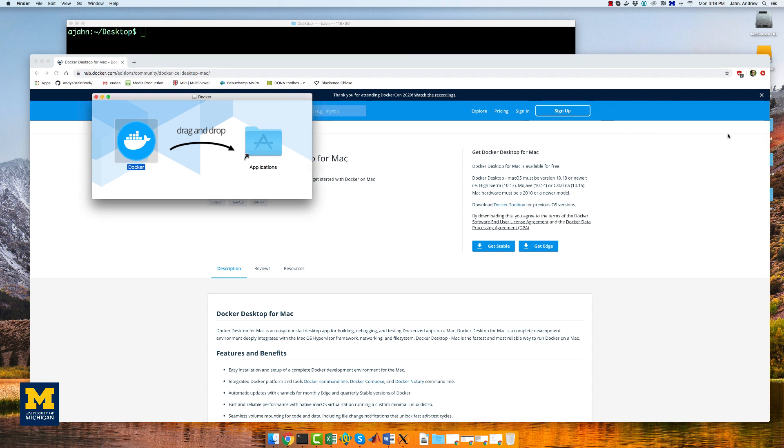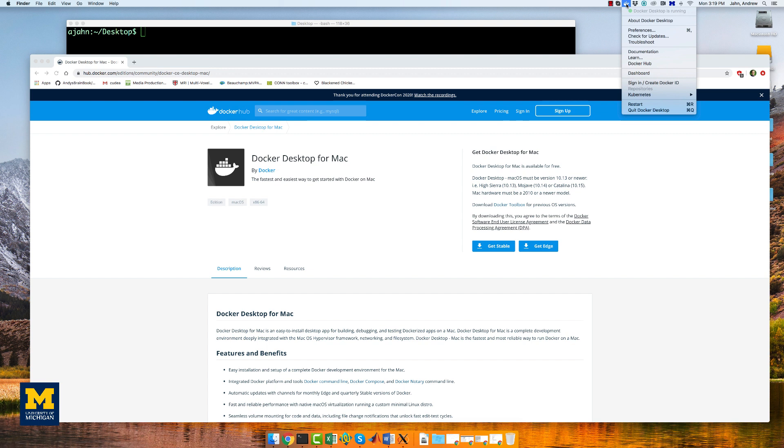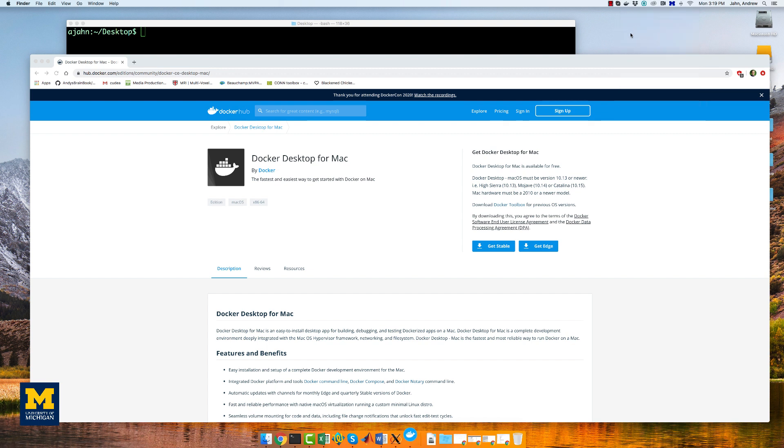But, once it is installed, you'll see this icon that looks like a whale with some bubbles on top of it. If you click on that, go to Preferences, and then click on Resources.